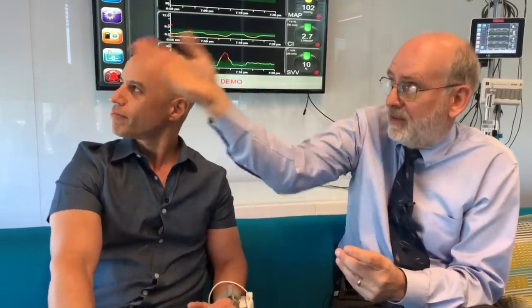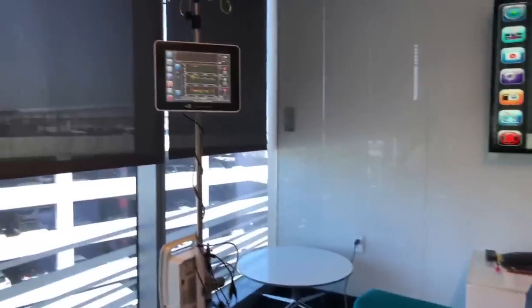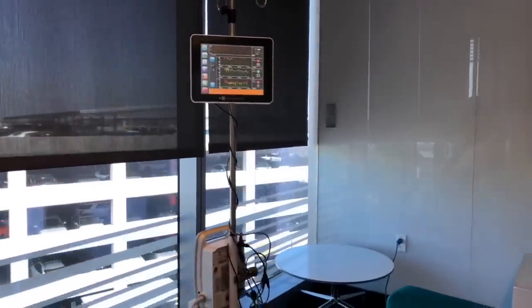It's coming. Well, I think they took a lot of the data from a monitor like this. So they looked at the shape of that blood pressure waveform, and they look at how broad or narrow it is. They look at the cardiac index, so how well the heart's working. They look at things like the stroke volume variation, and then they break it down to a bunch of other parameters. I think they had like millions of different parameters they looked at, and they just dump it all onto a big computer and say, figure out the best way.